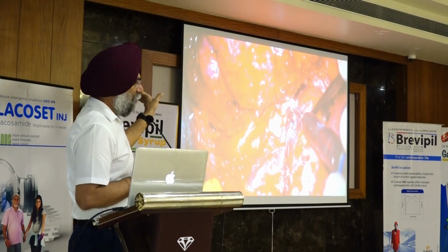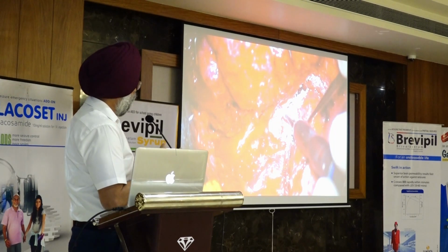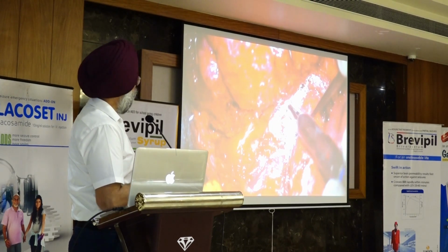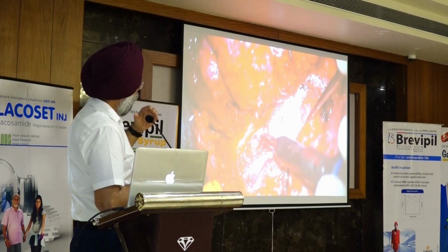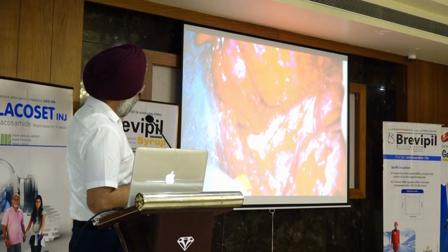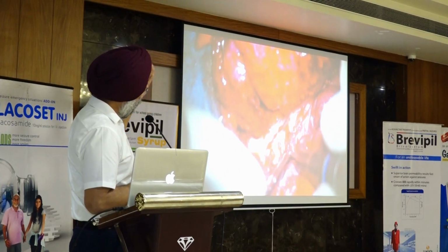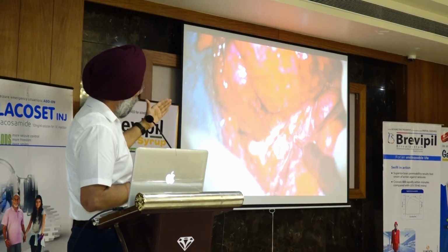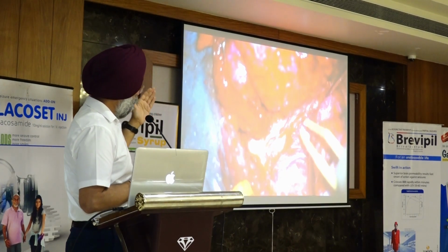Most of the time, in majority, I would say that in more than 90% of exposures, I don't require any orbitozygomatic osteotomy. Just zygomatic osteotomy and pulling the temporalis muscle down is more than enough. And then you have to flush the base of the temporal so that you are drilling absolutely vertically, making it into your direct vision.